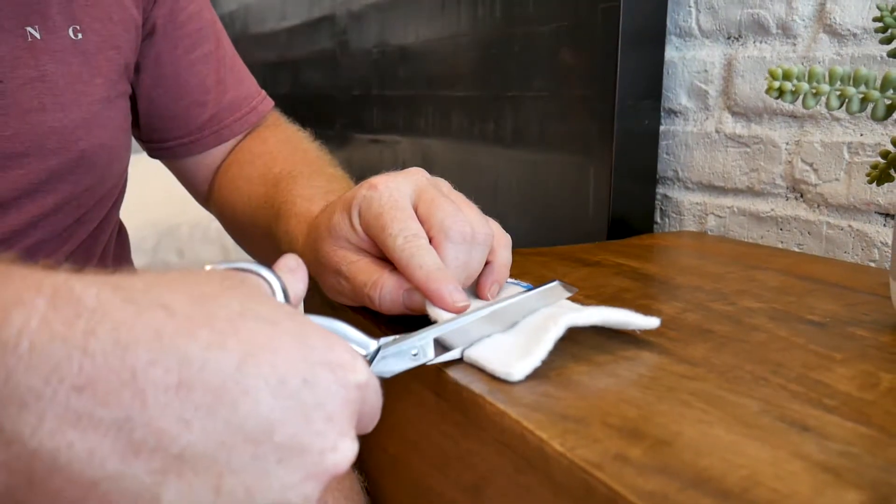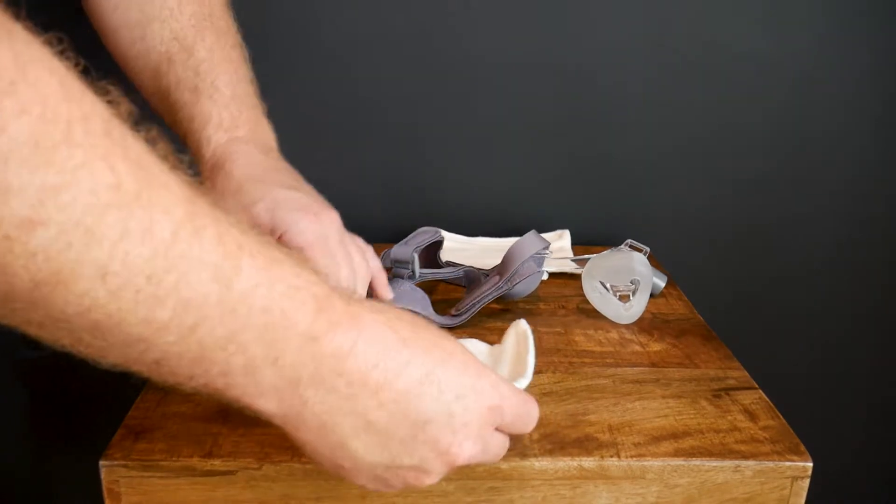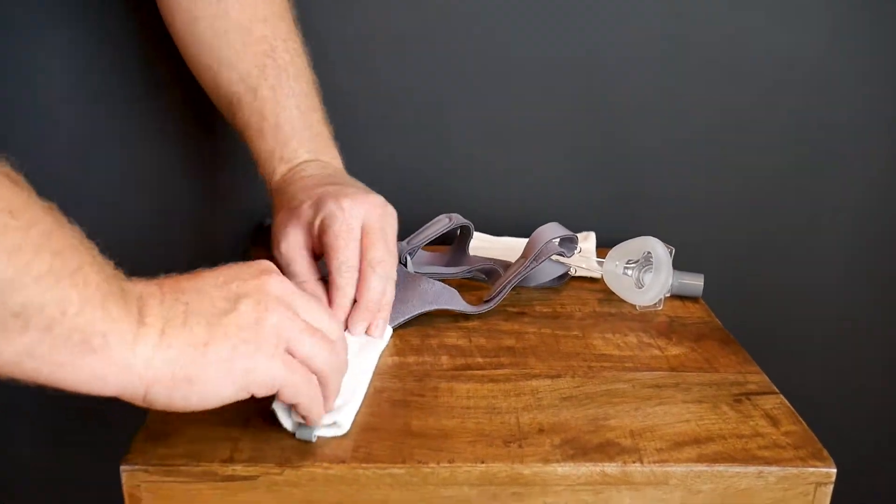For a more tailored fit, simply cut to size at the thread lines provided. To install, lay the covers open on a flat surface and place your headgear on top.